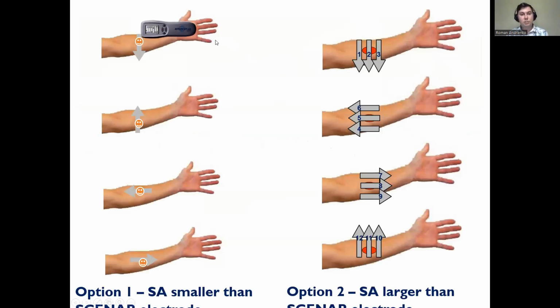All right, good example here. Local pain, great way to work with it. So this is the actual area of pain with clear boundaries. You see that we are slightly overlapping. We are doing 3 passages, up to down, right to left, left to right, bottom up. So we're covering all 4 directions.